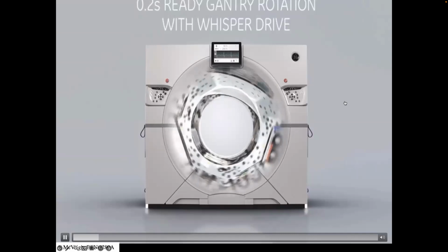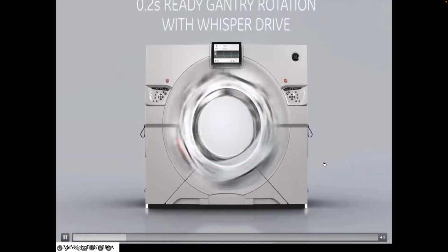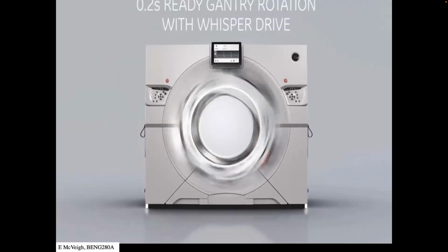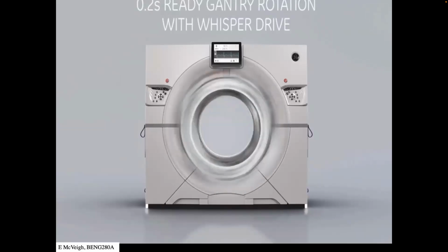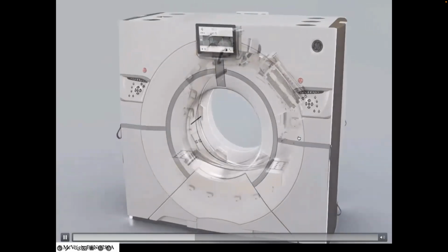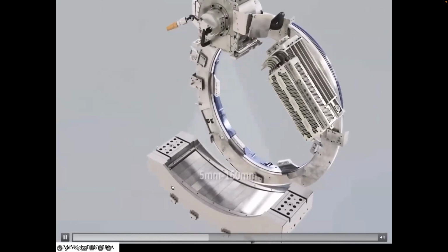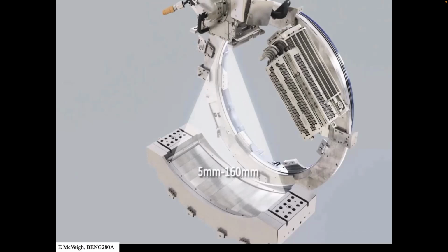This is the scanner we have here over in the Jacobs Hospital, from a really nice GE marketing video. They're really great at making marketing videos. These companies go all out, man. And they're really terrific. So here's the detector down here, X-ray tube up here. This is a massive power supply to create the voltage across the anode and cathode in the X-ray tube.